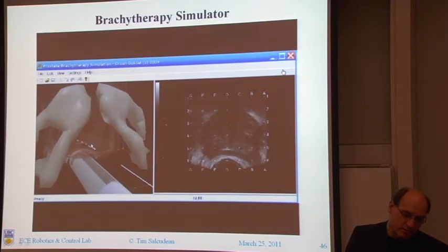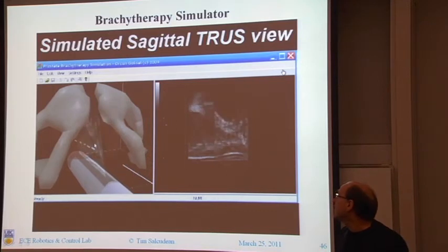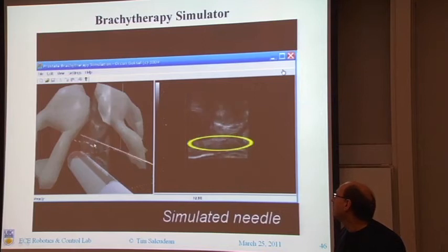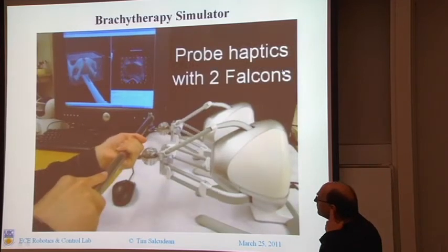They flicker in and out. They're very difficult to see, in fact, and they look exactly the way you see them. We can also do a simulation of the sagittal image of the ultrasound or the transverse, showing how the tissue deforms, and the needle artifact view in the ultrasound image, using the same superposition approach. What's the typical size of the seed?